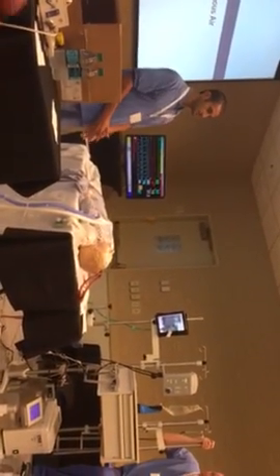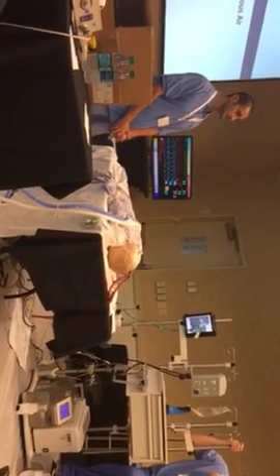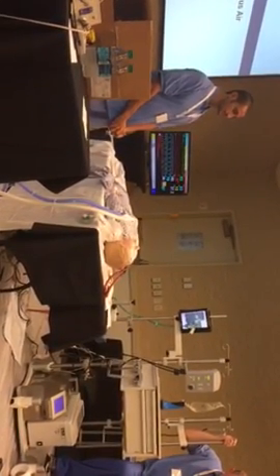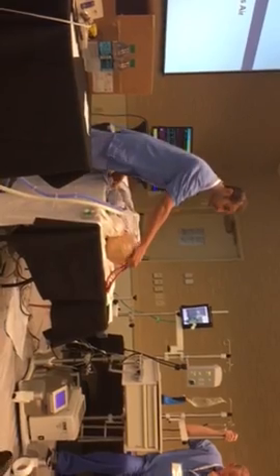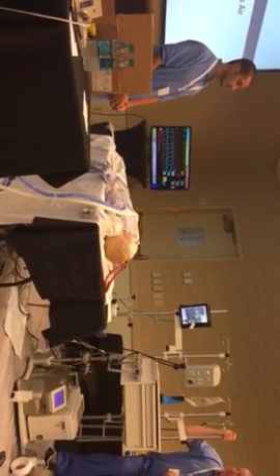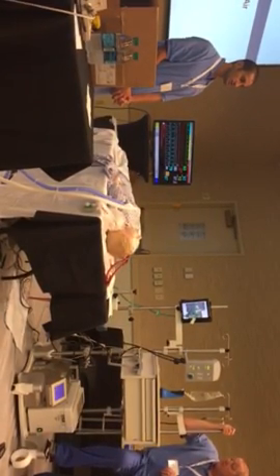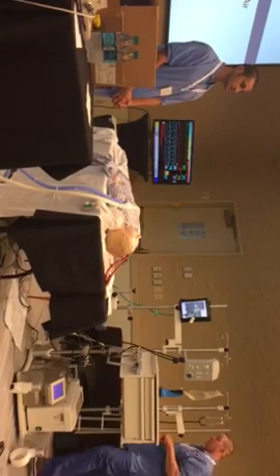Yeah. And you're asking about the cannula, for example. What are other potential sources? Open. Good. Yeah. Anything really along the access line pre-pump, if you have a connection, that could potentially be a source for air entrainment. Other than entrainment, what else could give you air on the pre-oxygenator, on the pre-pump side?